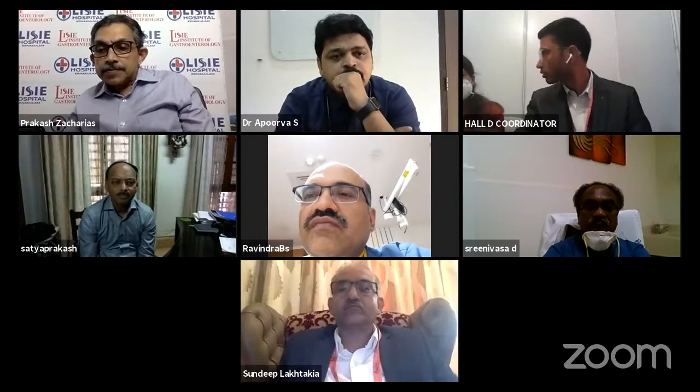Sandeep or Prakash, because it was not diagnosed early, and you puncture and you find out that what you get is frank pus. What will be your next option? So the question is, will you put a nasocystic drain? Yeah. Will you always put an expandable stent for that?